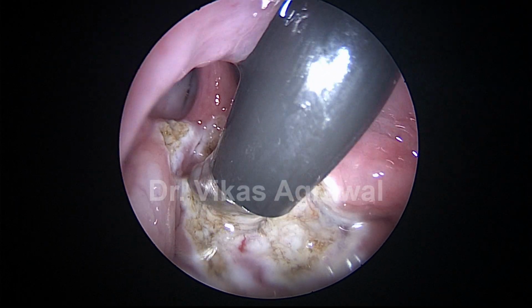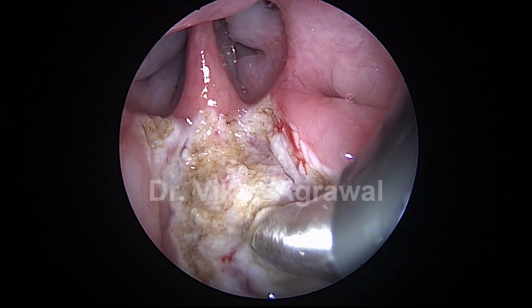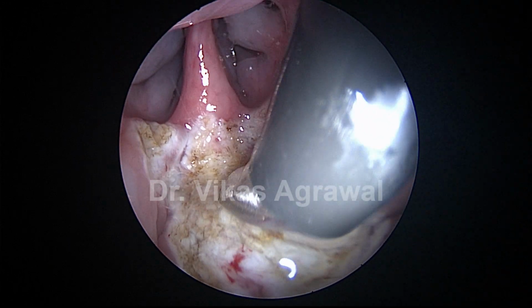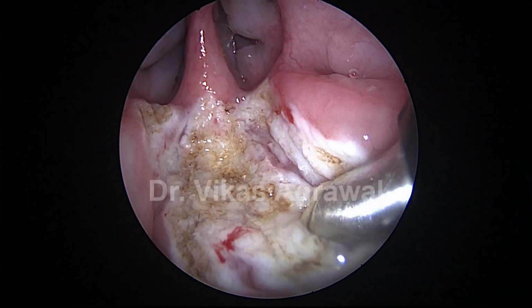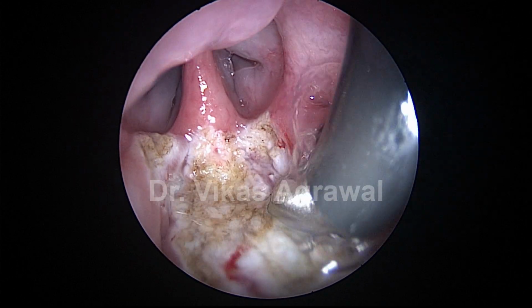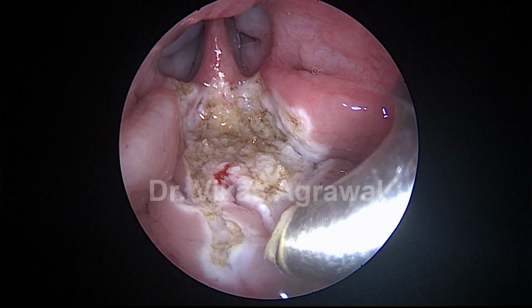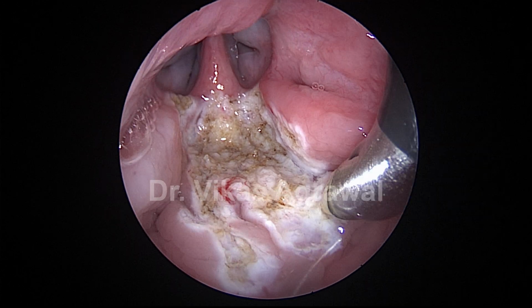Now I'm going towards the posterior boundary, which is a little more difficult to view from this angle. It's much easier to view when you are going from the nasal cavity, because there you see it head on, here you are seeing it side on. So anyway, I'll remove all the tissues layer by layer.